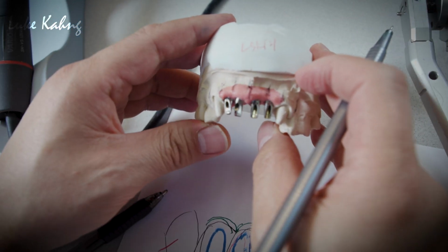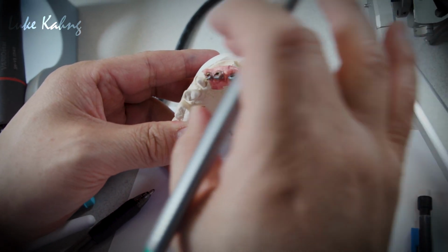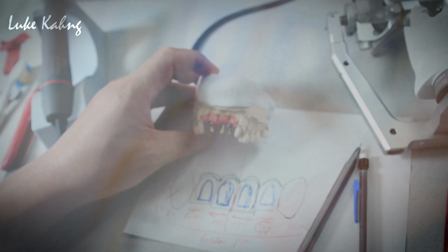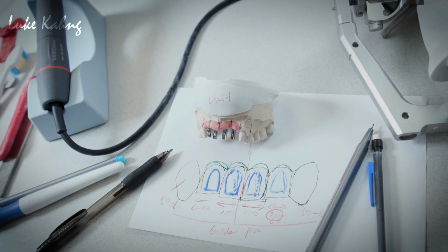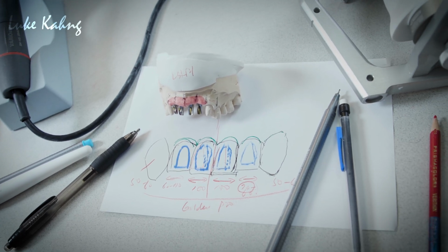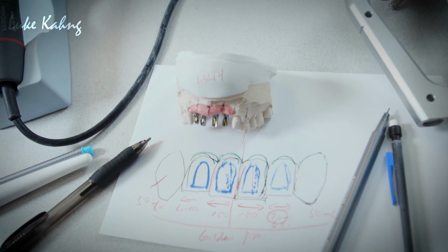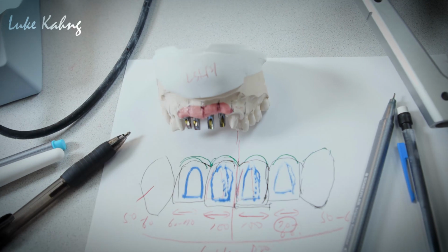Color, no matter what we anodize, no matter what. Then we can set up the frame design perfectly. That's number one. If a dental laboratory technician wants to make a pretty, cosmetic, top-of-the-line restoration, this is number one. We have to set the frame design and abutment, and then I'm going to finish the final work the best, to make better contours, everything.